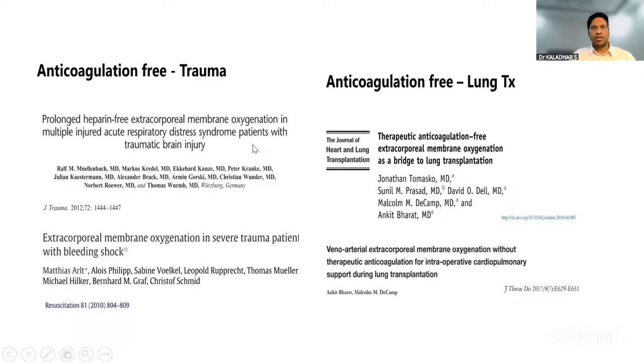There are, of course, many case reports of anticoagulation-free ECMO, especially in the context of trauma. Any patient developing ARDS may also have traumatic brain injury and ongoing hemorrhagic shock. When we contemplate going for ECMO there, we probably don't want anticoagulation in place.